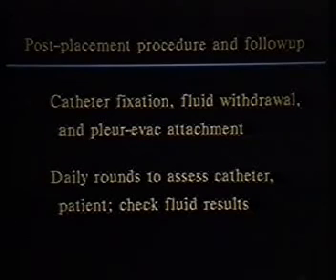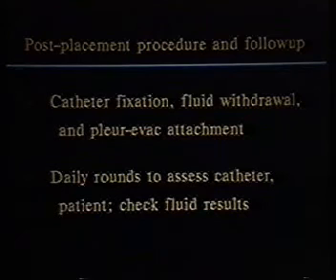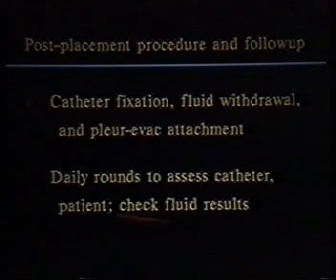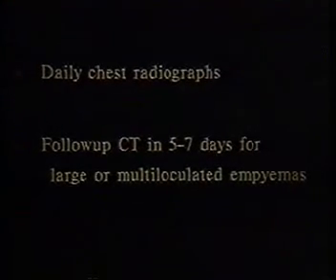It's very important to realize that although we are radiologists used to living our existence in the radiology department, you really do need to go on daily rounds to see these patients and assess that their catheters are in the proper position, that they're functioning properly, checking to make sure that the patients are on the appropriate antibiotics, that the catheters are flushed at least once or twice a day to maintain patency, and to make sure that there's no change in the character of the fluid that might suggest either superinfection of a sterile collection or perhaps a laceration of lung, as might be evidenced by a bronchopleural fistula that develops, or the development of bloody discharge from the tube, which might suggest that one has lacerated either the lung or an intercostal vessel.